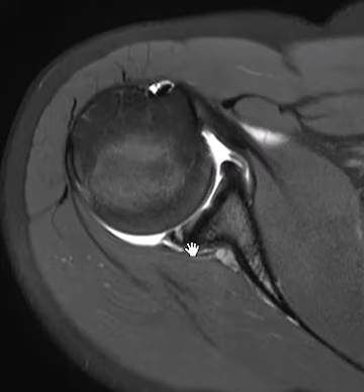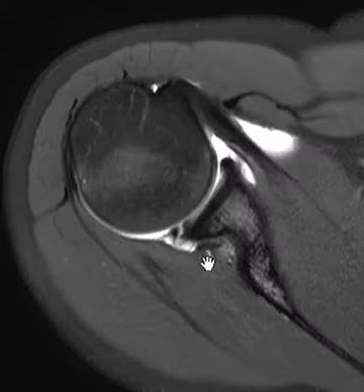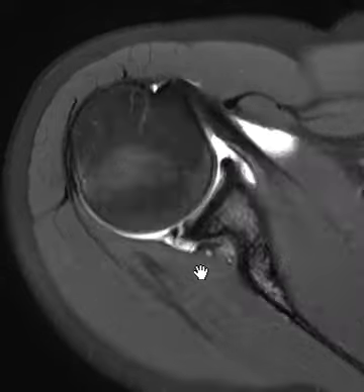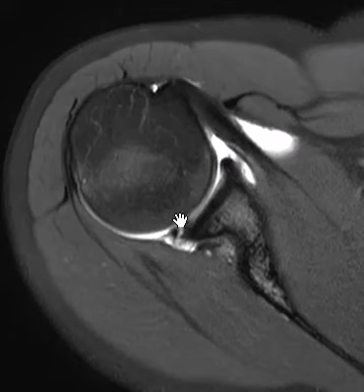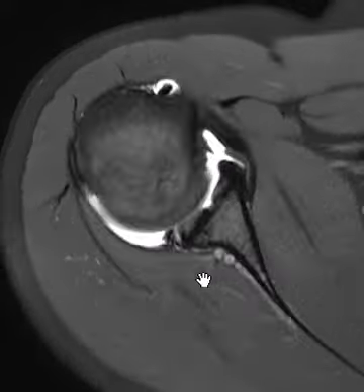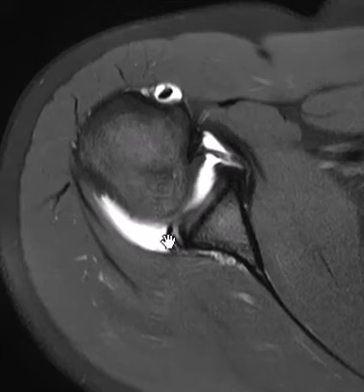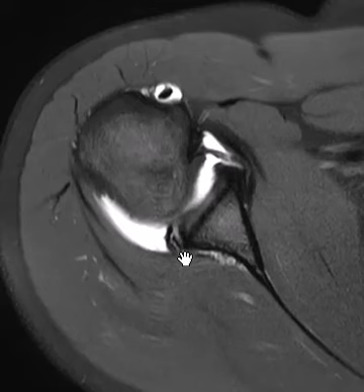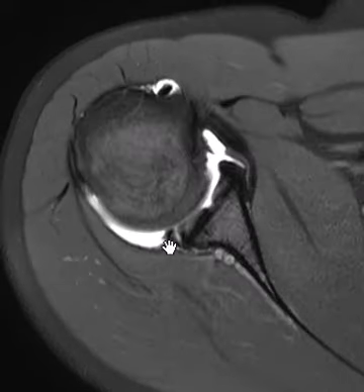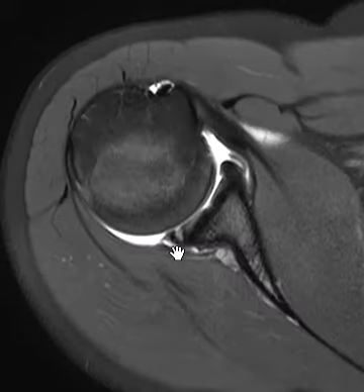So this is a complex tear. Is it detached? If you look here, you can see this fluid going all the way from the articular surface back. It looks like there's a little detached fragment there. And even here, the torn labral fragment is really not attached — it's just hanging on by this posterior capsule. So it looks like it is detached. I would say this is a complex tear that is detached, but there is no labral displacement — no displaced labral fragment.